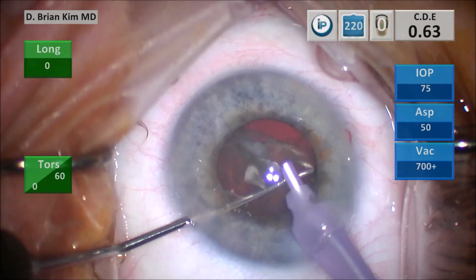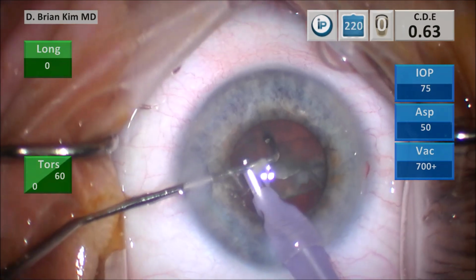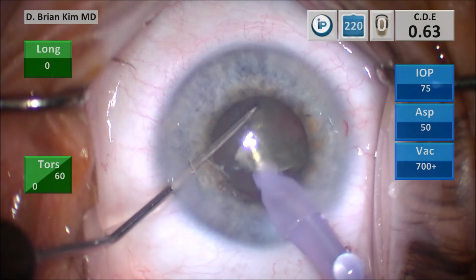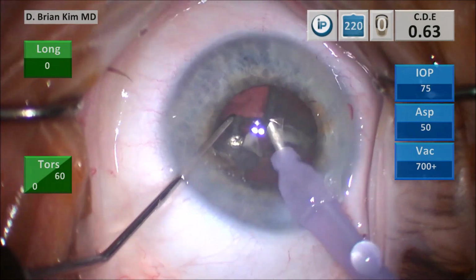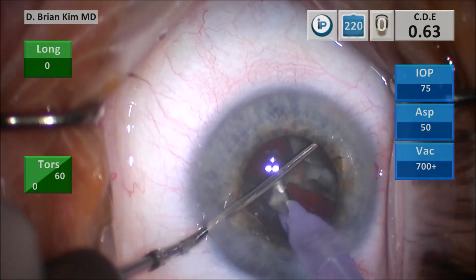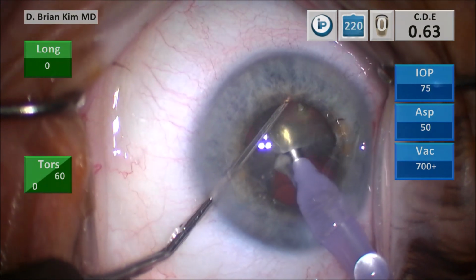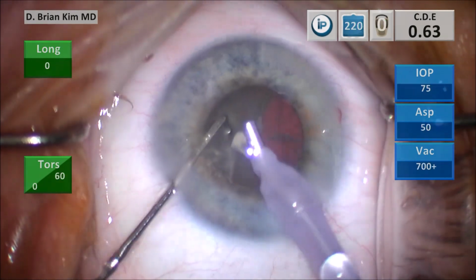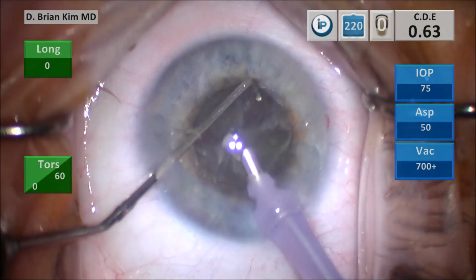I rotate the second heminucleus in front of me, place the chopper out to the equator, place the phaco tip deep in the bag. You can see I was able to crush and divide that second heminucleus into the third and fourth quadrant. I place the chopper out to the equator and I crush the third quadrant, dividing it into smaller pieces, using the vacuum to help manipulate the lens pieces, and then crushing it between the chopper and the phaco tip.